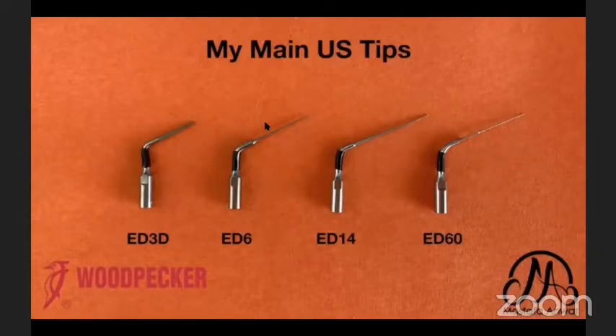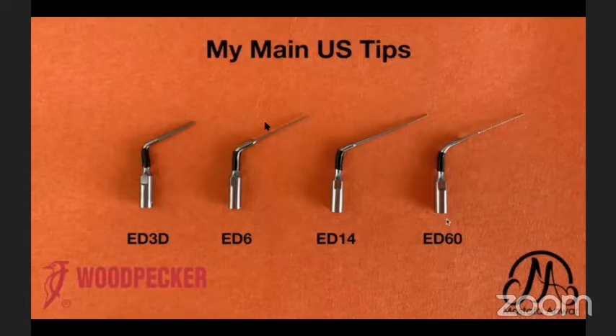I will show you some of my main ultrasonic tips used in my clinic. The ED3D I use mainly for access cavity refinement. It has a cutting end and side cutting, like a tapered stone with rounded end — useful for access cavity refinement, troughing for hidden canals, and removal of pulp stones. Troughing means peeling the tooth structure, like peeling an orange crust to reach the slices — we peel the calcified tooth structure over the MB2 canal or the middle mesial canal.